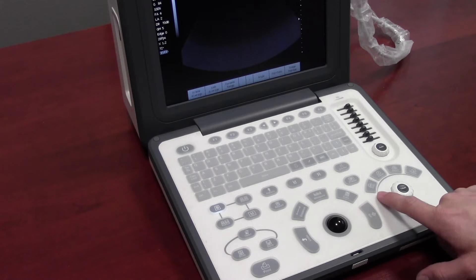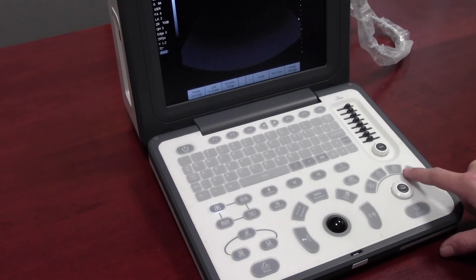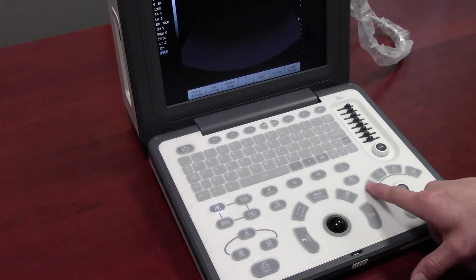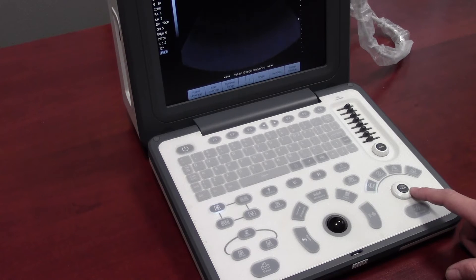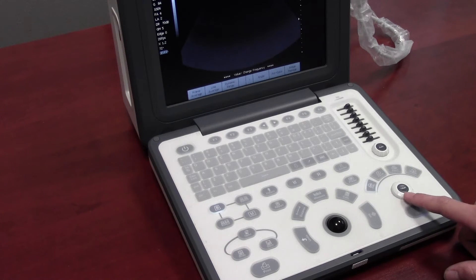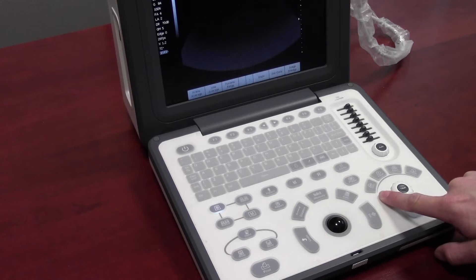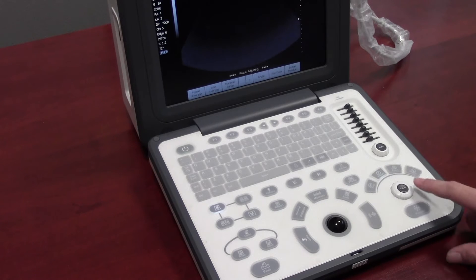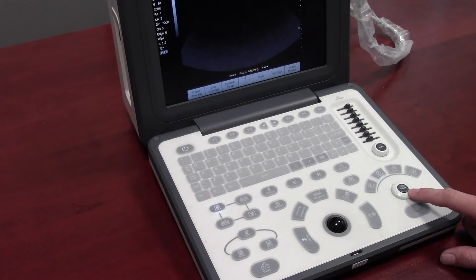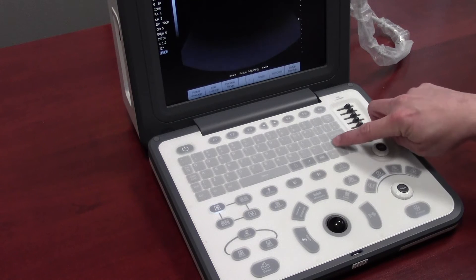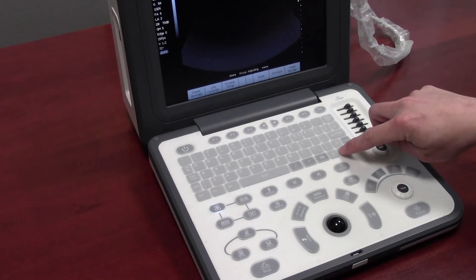Down here we have the frequency keys, focus, zoom, and depth. To change the frequency, press frequency and use the encoder. To get out of frequency, press the frequency key again. Press focus and rotate the value encoder to change the number of focus positions, or you can use the trackball to move the individual focus position, as well as the up and down keys on the alphanumeric keypad.